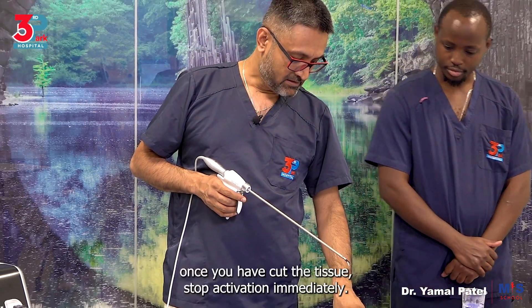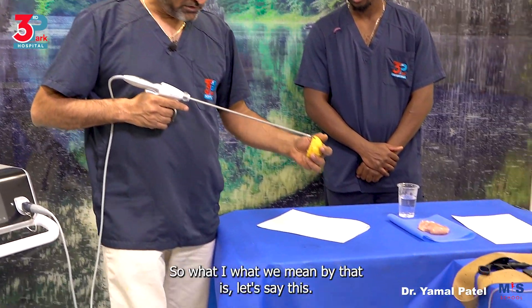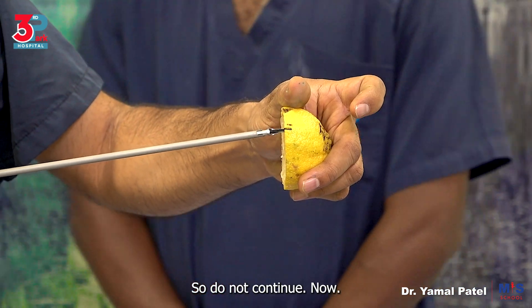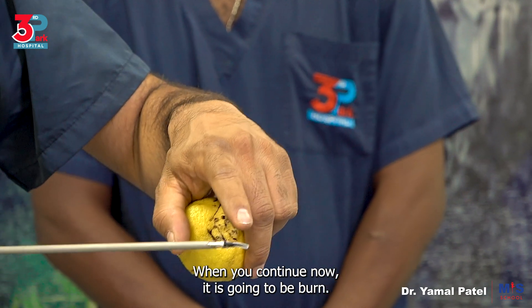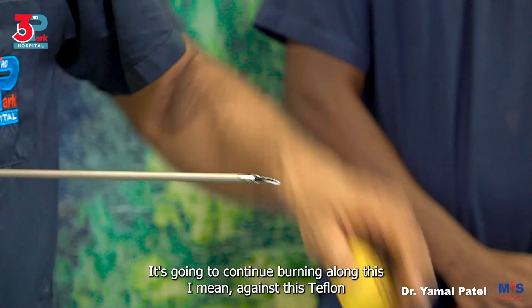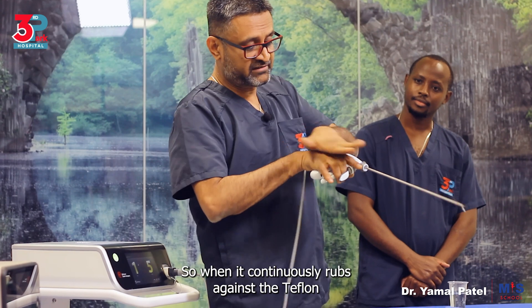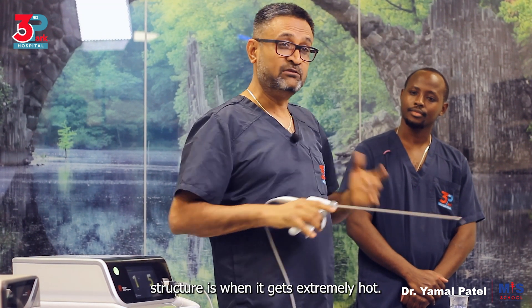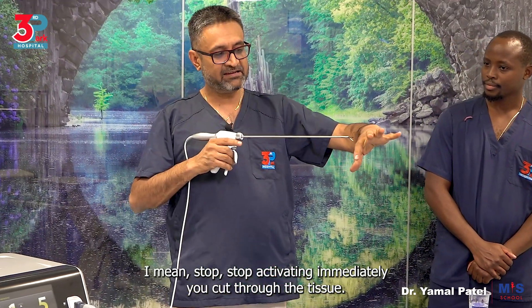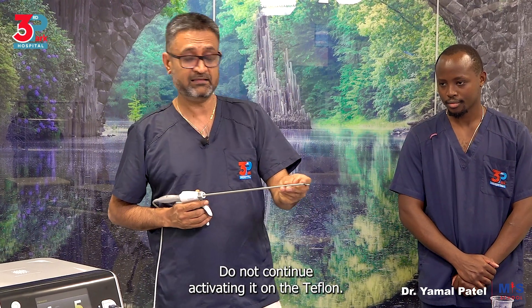Once you have cut the tissue, stop activation immediately — do not continue. What we mean by that is: once it has cut through, do not continue activating. When you continue, it is going to burn and continue burning against the Teflon structure. When it continuously rubs against the Teflon structure is when it gets extremely hot. So stop activating immediately once you've cut through the tissue — do not continue activating it on the Teflon.